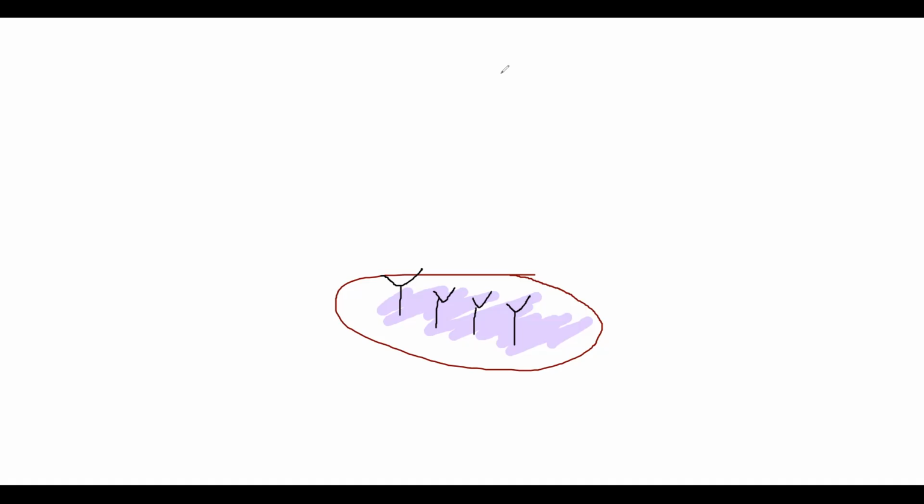If I want to find out whether or not the patient has streptococcal infection, I will take a little bit of agar, put the patient's anti-serum onto the agar gel, and add an antigen that I know will react with beta streptococci. Let's suppose these are the antigens. If it is beta streptococci, these two will attach and there will be precipitation. If it is not beta streptococci, you already know antigen and antibody reactions are very specific. Only one particular type of antigen will attach to a specific type of antibody. It will not attach to any other antibody. The same way, if beta streptococci is present in the patient, the precipitation reaction will occur. That too, you will see different bands on the agar gel. If it is not beta streptococci but some other bacteria, then this antigen will not be able to attach. Hence, it will help in diagnosis. Okay, that is one way.